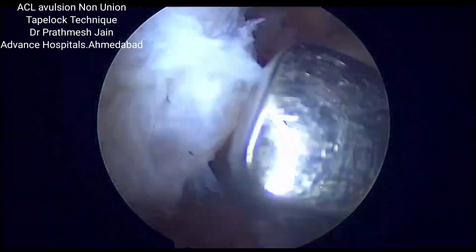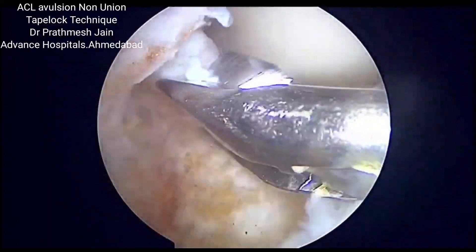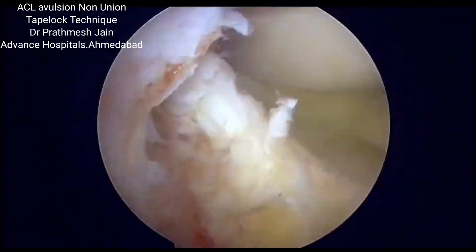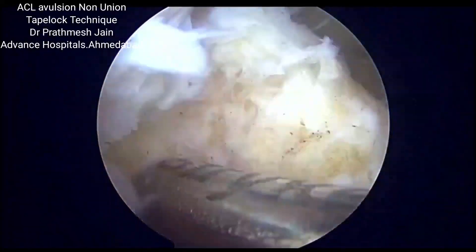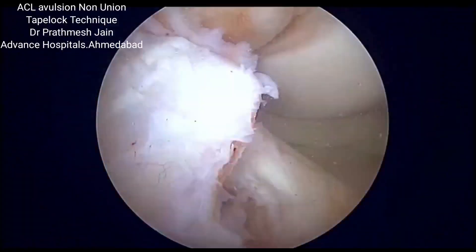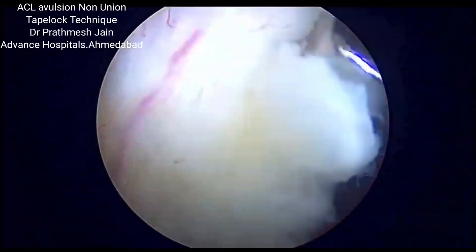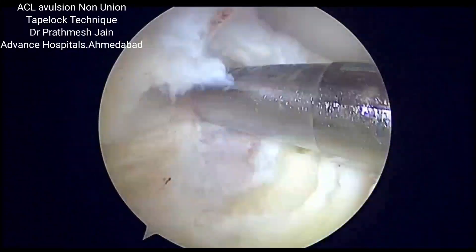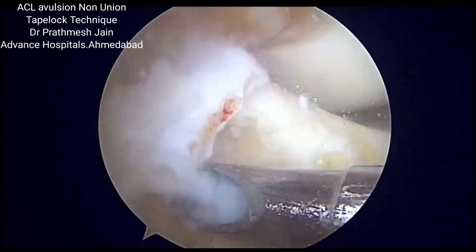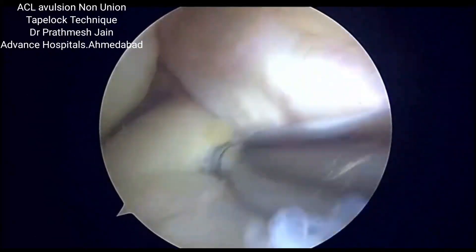A thorough preparation of the bed, crater, and the fracture fragment is needed so as to ensure bone-to-bone healing of the bone fragment and the crater. Once we are sure that the preparation is good, we are ready to start the tape lock technique of ACL avulsion fixation.